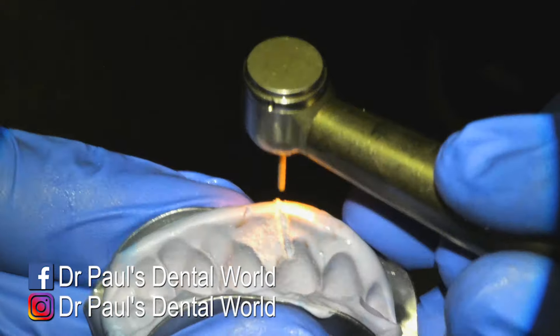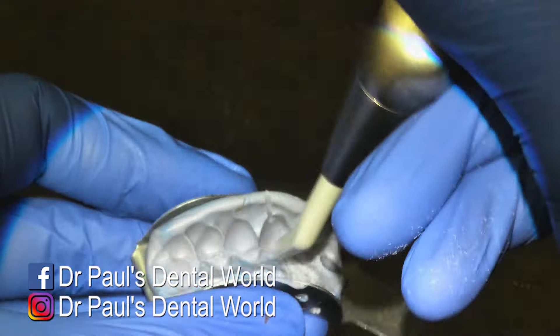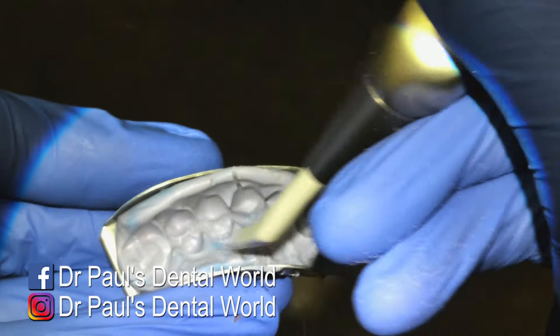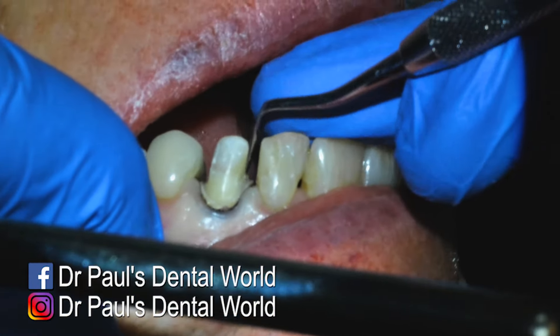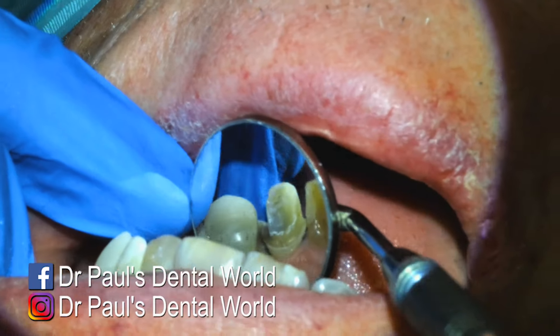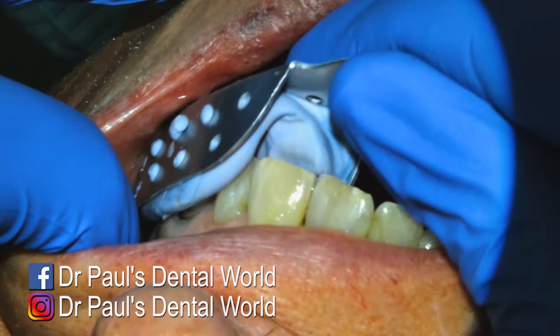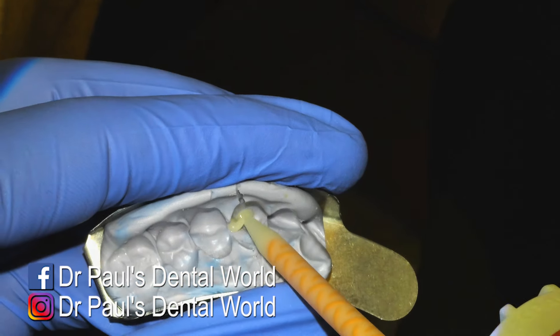And then it comes time to add the channels. So I do one on the buckle and one on the palatal, making sure it goes all the way to the apical portion. They don't have to be on different angles, but you can if you want to. Now my crown preparation is done, so it's time to make the temporary crown. First thing is I'll practice seating the tray in. Then I'll bleed some on the back of my glove and load it into the tray.